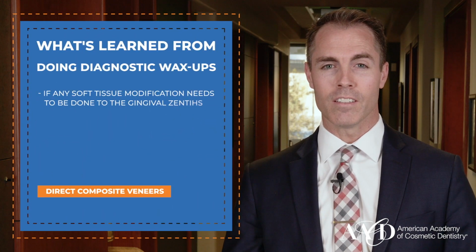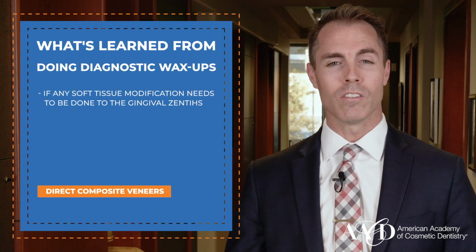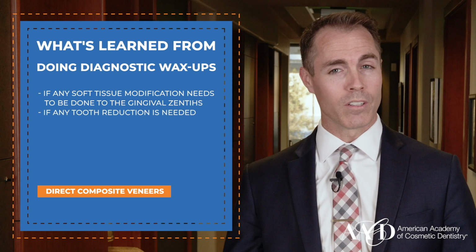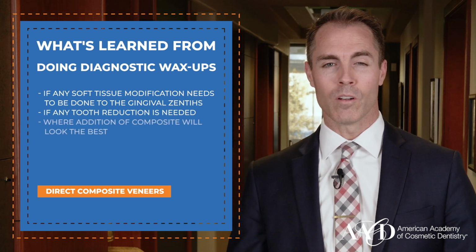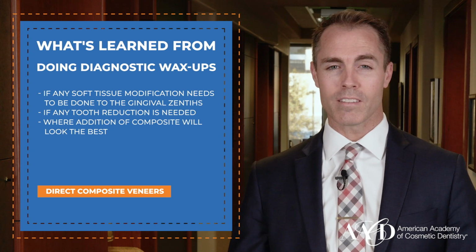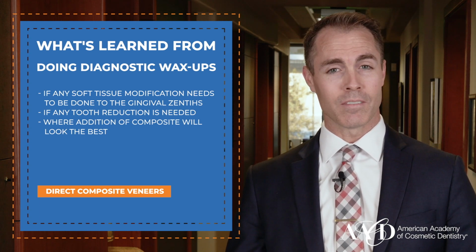So, alginate impressions were taken, and 2 sets of models were made from which I fabricated bleaching trays and a diagnostic wax-up. I do my own diagnostic wax-ups, and I highly recommend this practice to you because so much information is learned in the process. I learn if I need to do any soft tissue modification to the gingival zeniths, if any tooth reduction will be needed, and if so, how much. I learn where addition of composite will look the best when dealing with excess spacing.